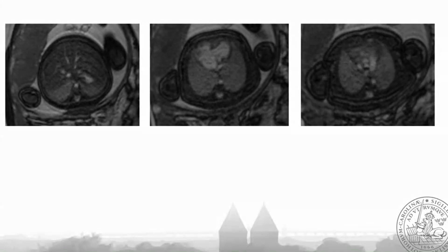So going back to that image to the left, the pulsating white dot in front of the stomach is actually a quite extensive vertical vein, in this case of total anomalous pulmonary vein drainage, going down to the portal vein system quite far down into the abdomen.